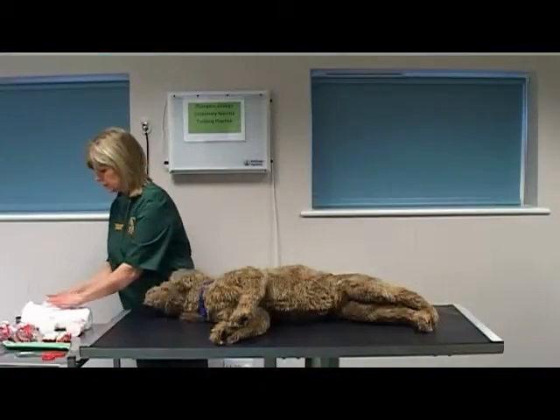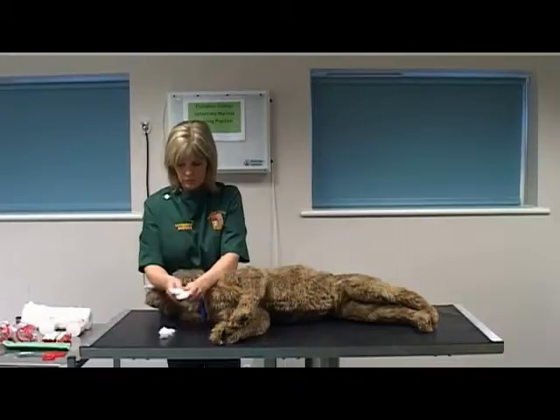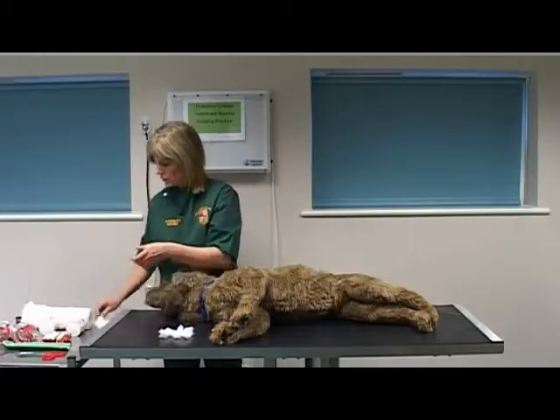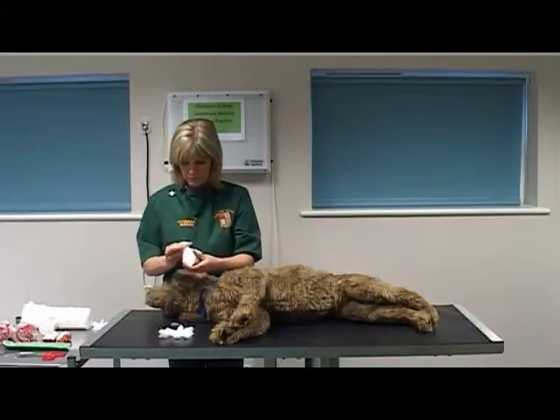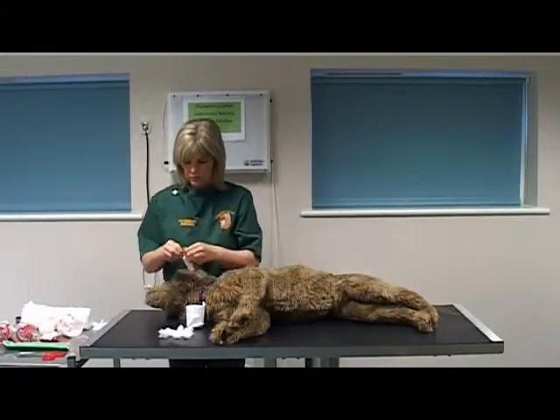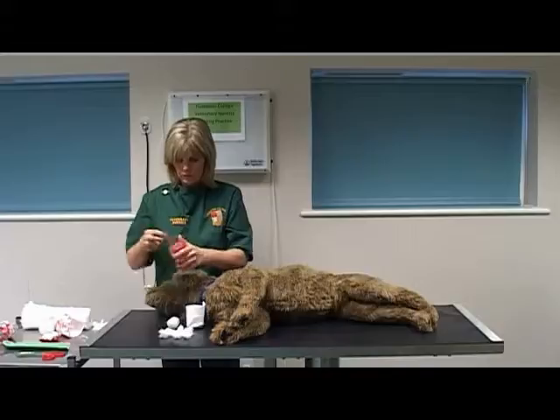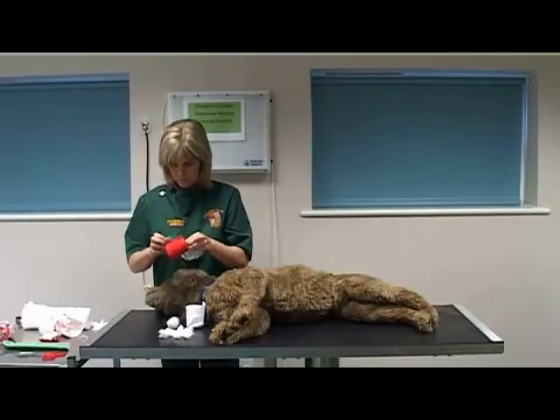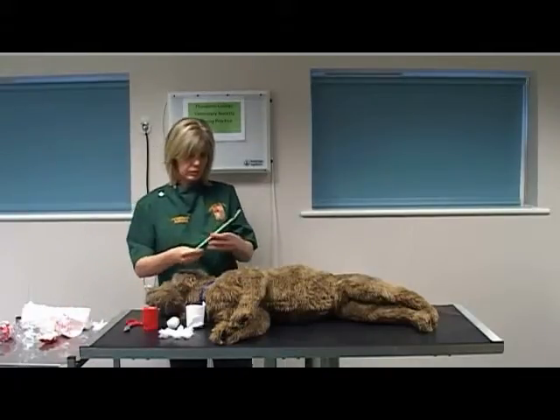Select and unwrap materials and equipment prior to starting the bandage. Select a small amount of padding to place between the toes. Select a synthetic padding bandage. Select a conforming bandage. Select a protective layer. Select a pair of scissors. Select an appropriate size splint.